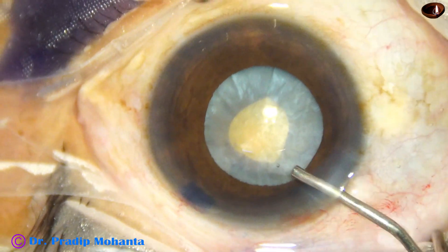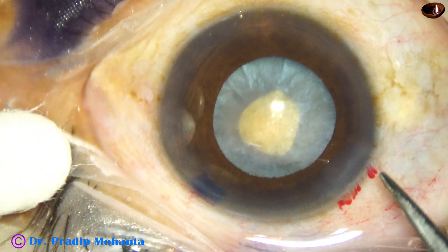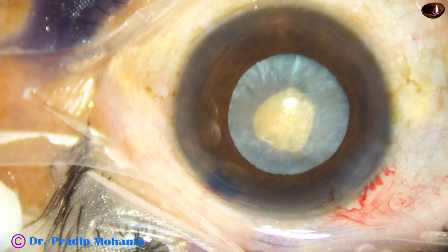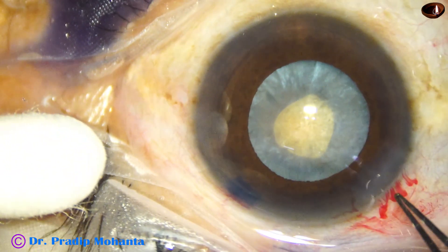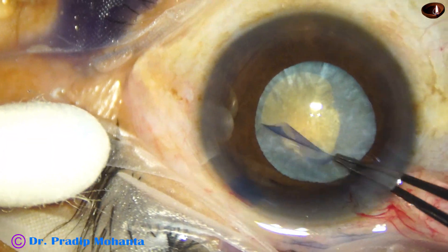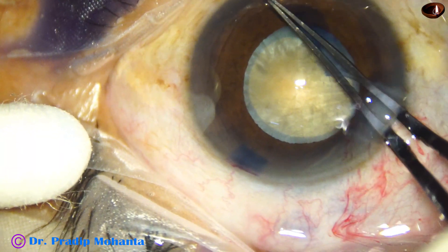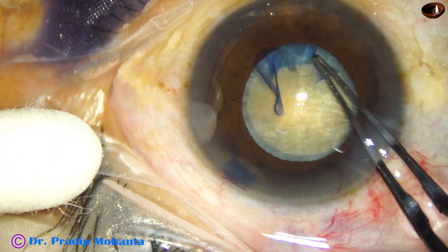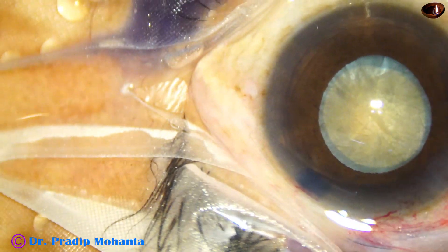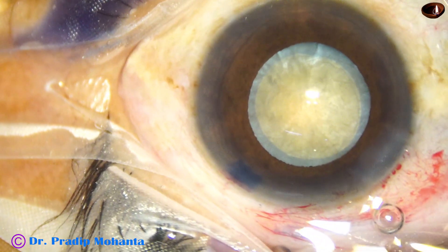The viscoelastic is injected and the anterior capsule is flat. When this happens, the chance of rhexis runout is almost zero. I have made a nick and now I take the utrata forceps, hold the capsular tag, and do a rhexis along the border of the pupil to get an adequate-sized rhexis of about 5 mm. Once this is done, the case can be managed even if intraoperative miosis occurs during emulsification.